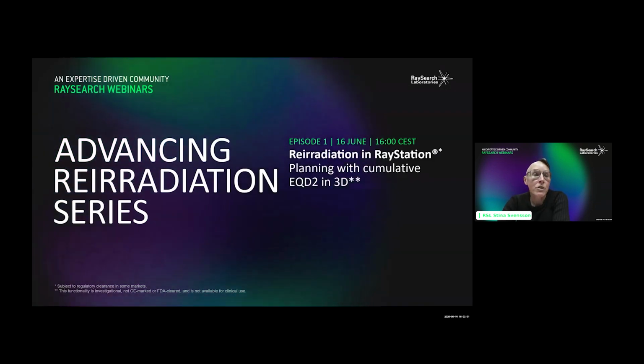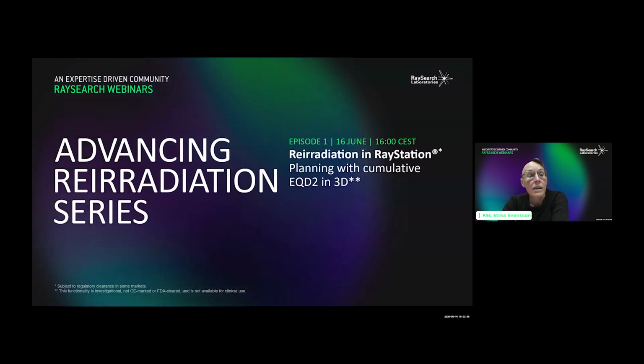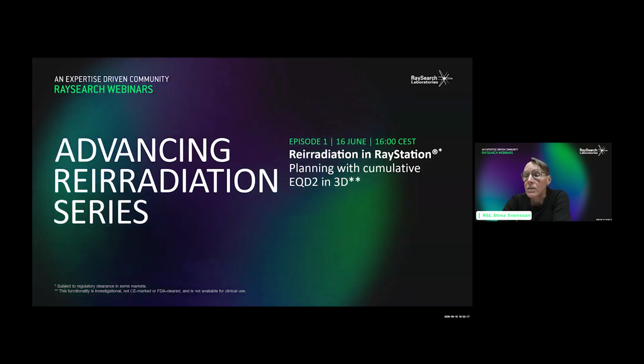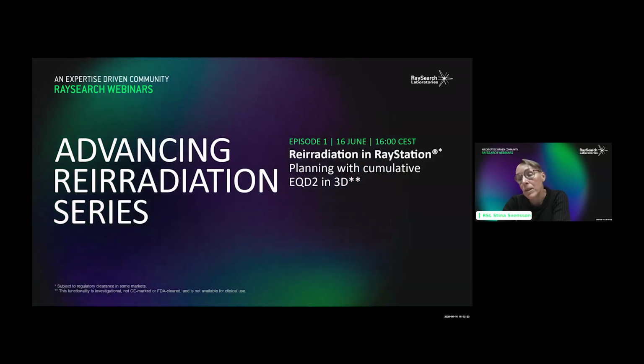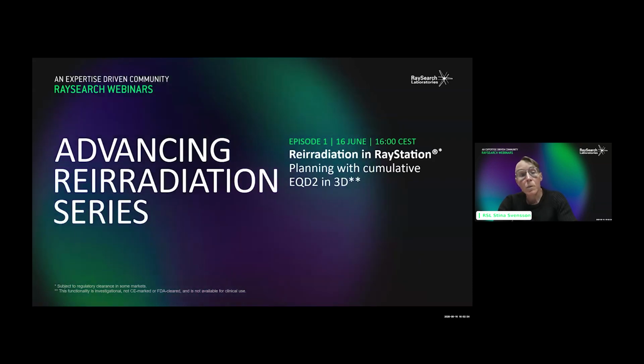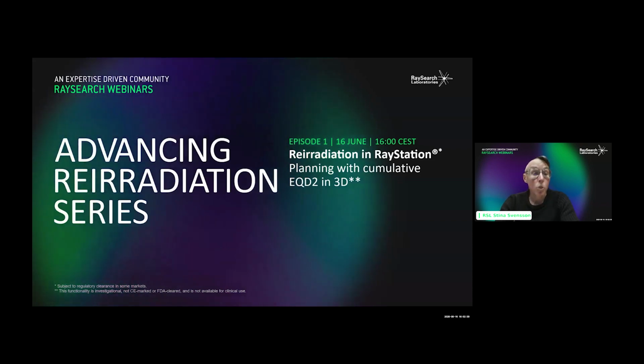Today we will have the first episode of our new series on advancing re-irradiation. In this series, we will bring together experts from RaySearch and from leading clinics around the world. We will explore the latest advances in re-irradiation planning and how they can help us to take safer and more informed treatment decisions. We aim to showcase new features in RayStation, practical clinical workflows, and case examples. This series will be given in 3 episodes, this one and 2 more that will be held during the autumn.